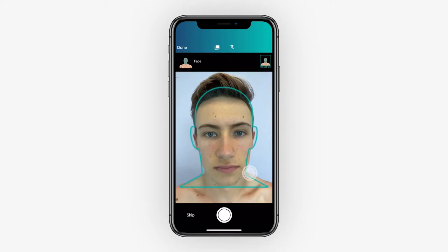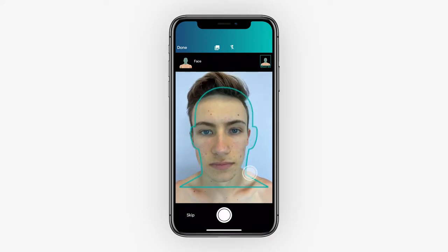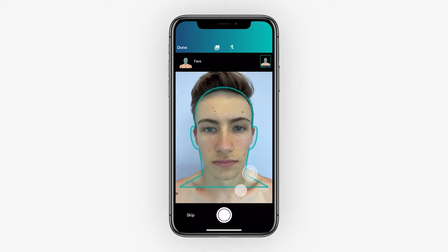To help ensure images are captured from a consistent distance, an imaging outline will appear for you to center the patient's body part. You also have the option of turning it off by tapping Ghost Off in the corner. Make sure you tap to focus and press the camera button.